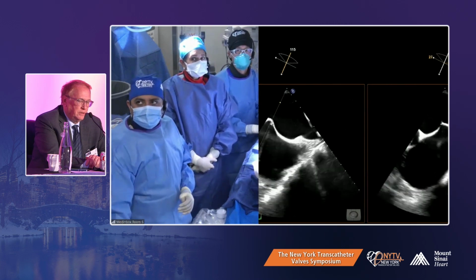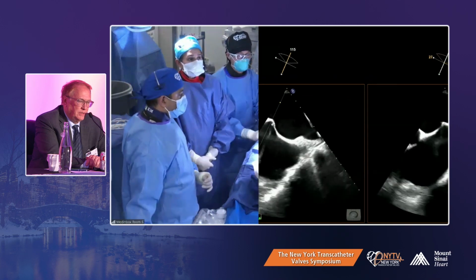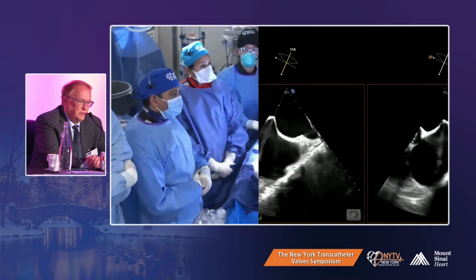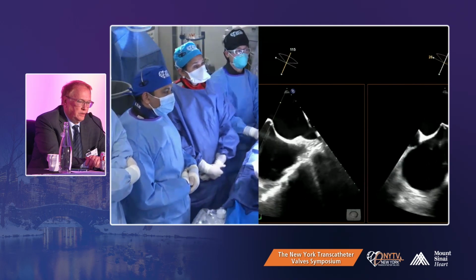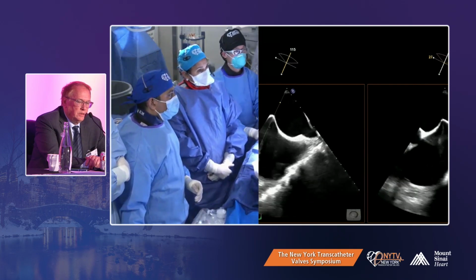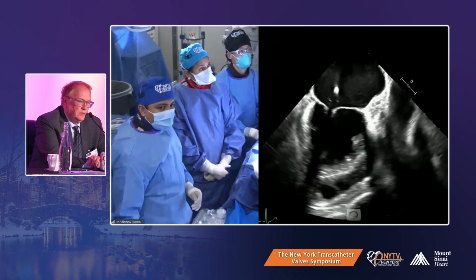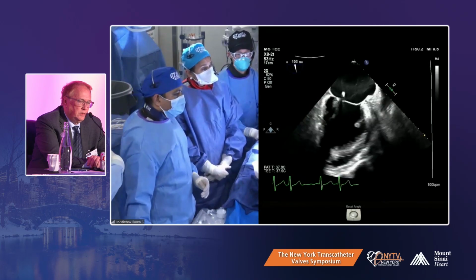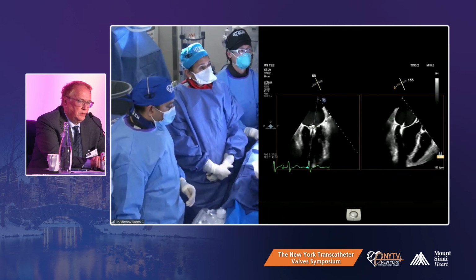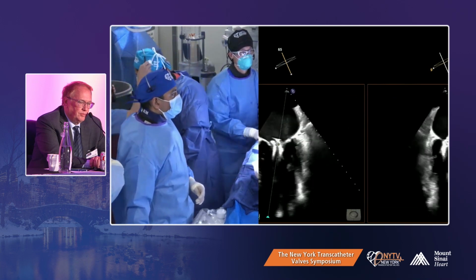What you did is a low puncture and posterior, right? On the bicaval view, the distance was about 5.5 the first time. It was a big atrium, so it's not low, but maybe more inferior, as you said. So we went more posterior this time. You can see that here. In the bicaval view you are low, and in the short axis you are posterior. That prevents you from being a posterior wall hugger. Yes. So you can see now, we put in one XTW.